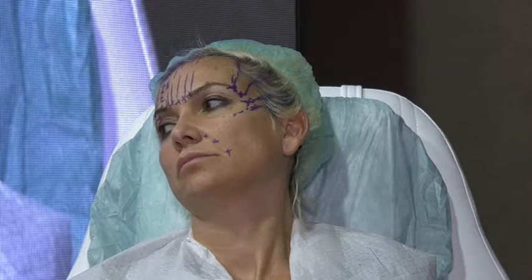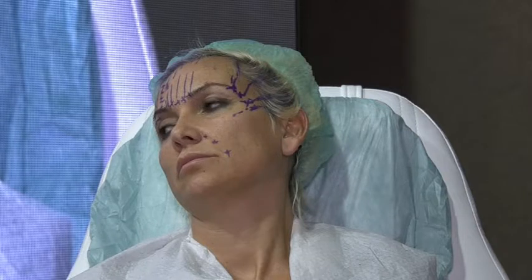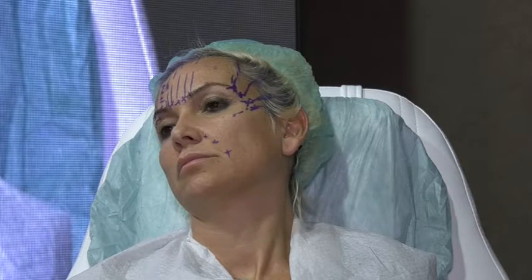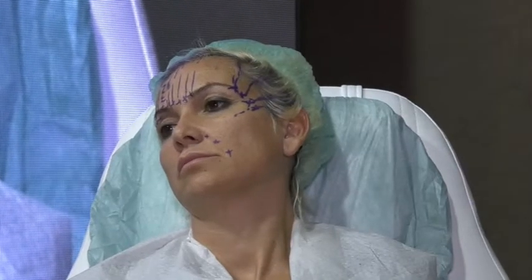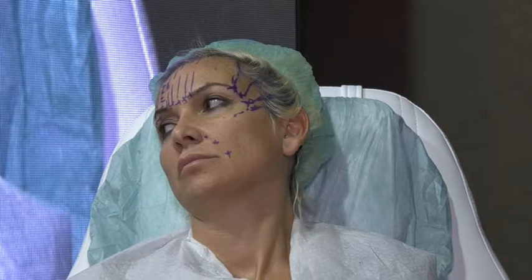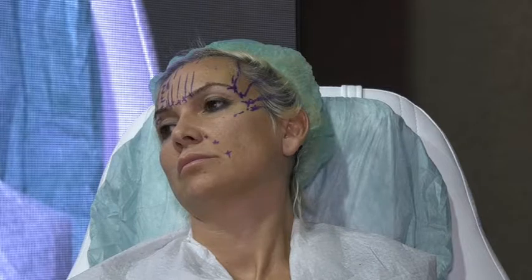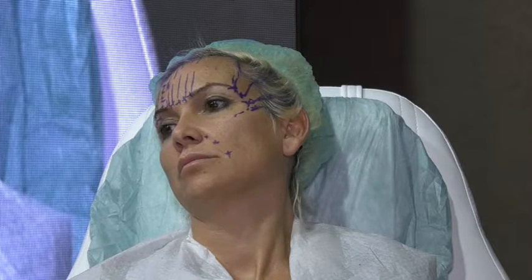So do it, except if you have a male. When you have a male, are you going to do the same shape and collect them to one point? No, because you will give a feminine look, a feminine cheek. So what we do with a male is design the standard point where I would collect the thread, and half a centimeter medial to it and half a centimeter lateral to it, I can add the other two threads. The standard one will be the middle one.